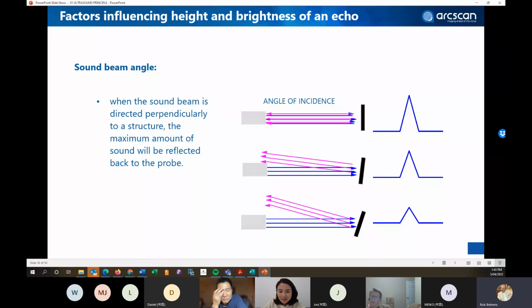The NMPA material did go in. The paperwork calls 50, but when you look at the spec sheet, it speaks to 30 to 50. So all of the specifications and all of the reports that were submitted to the NMPA did indeed specify the range.